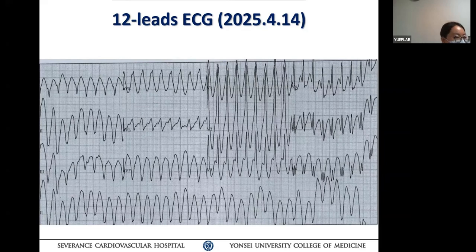So, who wants to comment next? Wide QRS tachycardia with superior axis, and aVR is up. aVR is a monophasic R, that goes in favor of VT. And it's an RBBB morphology, but we have S waves in V5, V6, and lead one is negative. So it's coming from the left lateral wall. Sort of notching in the QRS, likely a scar VT from left lateral.